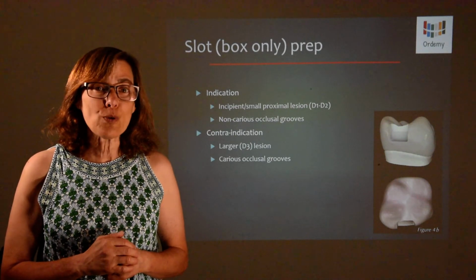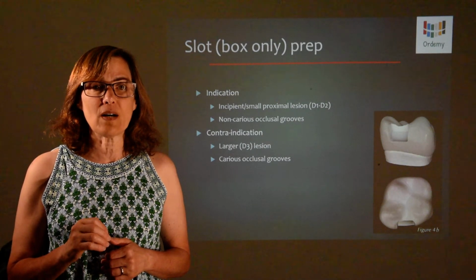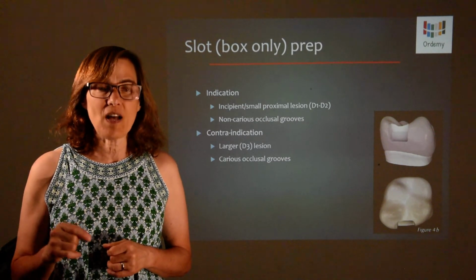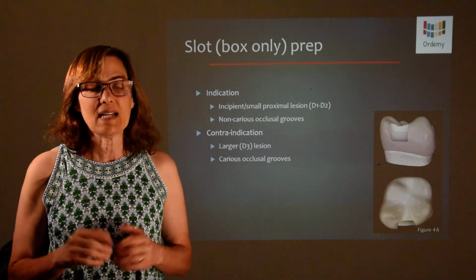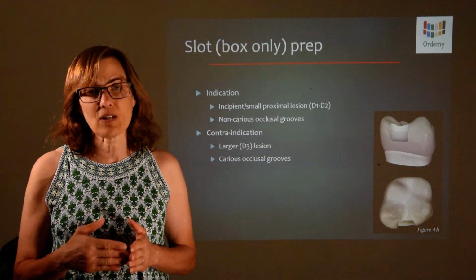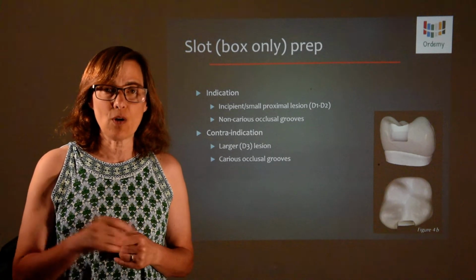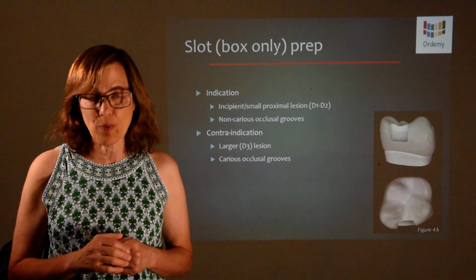Okay, the larger the decay, the more difficult it is to solely have this box form. It's going to depend on the dentist's determination if the occlusal surface needs to be incorporated in the filling. The smaller the filling, more likely it's a box. The larger the filling, the more extension of the box, and the more likely the developmental occlusal portion of the tooth is going to be incorporated in the filling.